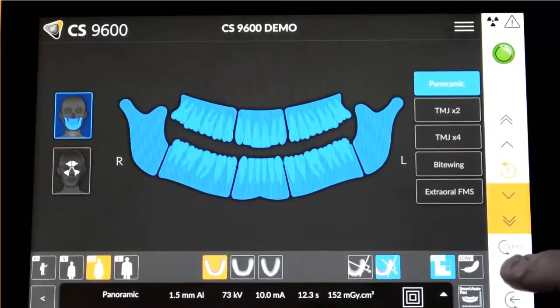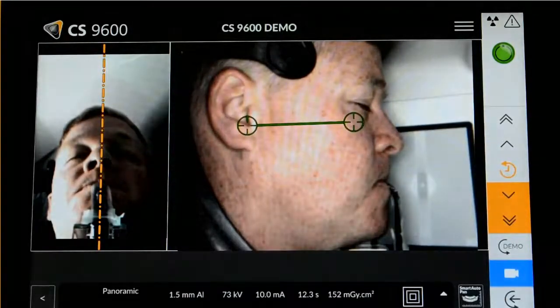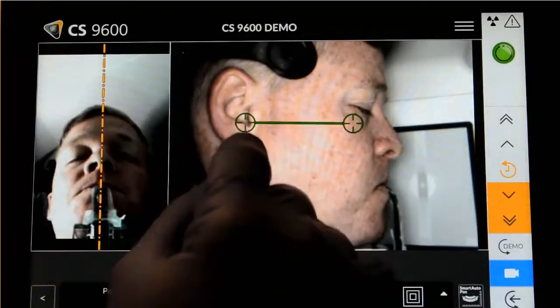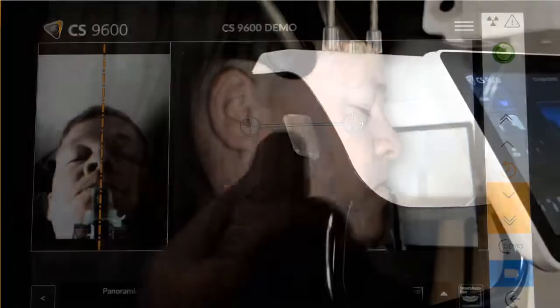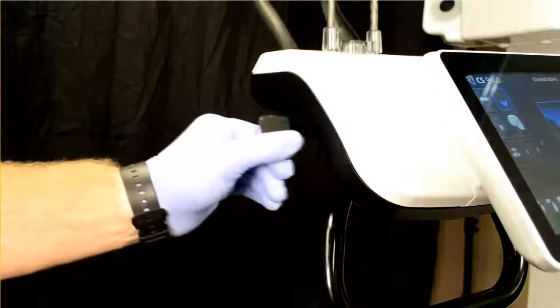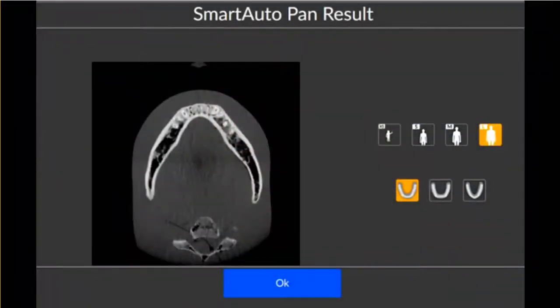On the control panel, select Live Positioning Assistance. Place two points for the Frankfurt Plane. Position the patient head with your hands using the mid-sagittal positioning line for vertical alignment and the horizontal positioning line for Frankfurt Plane alignment. Immobilize the patient head with the temple supports and tighten them using the temple support adjusters. On the control panel or workstation screen, select Smart Auto Pan to activate the optional Smart Auto Pan function. It provides recommended exposure settings for patient size and jaw morphology. If you need to change settings, make your selection on the parameter display panel.